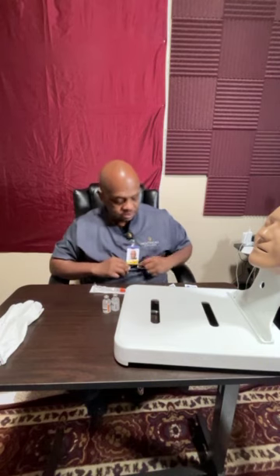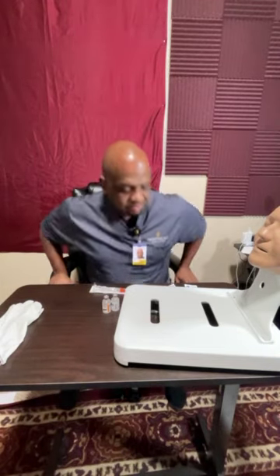The reason why I'm here, I'm going to be performing a video of drawing up insulin. First things first, I am wearing my ID. I am wearing my full uniform, scrubs. And I'm sitting to make sure that I'm seen on camera.